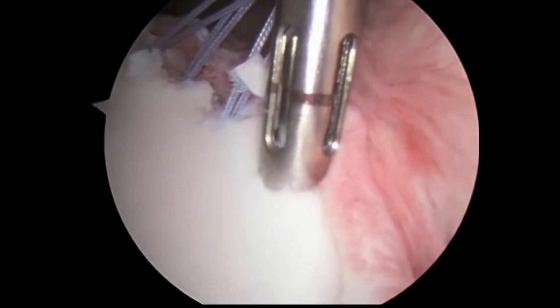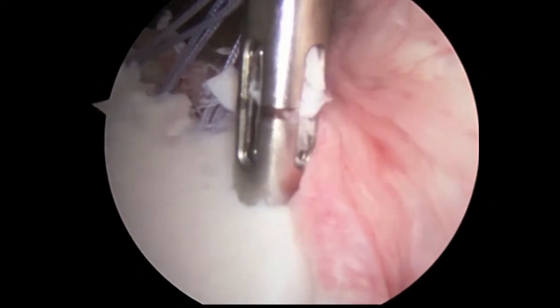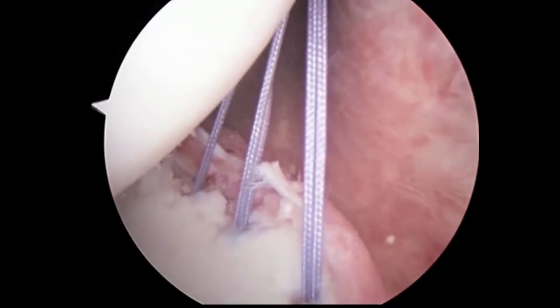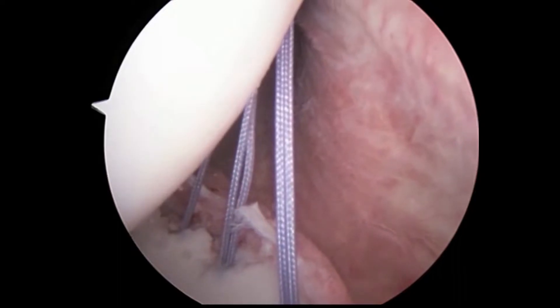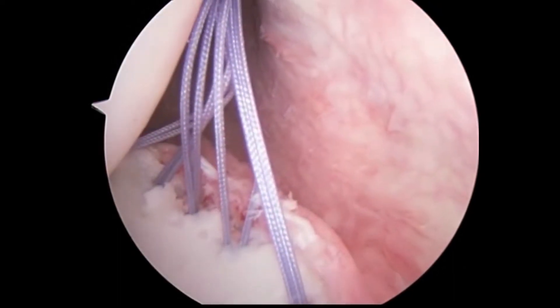The number of anchors is dependent upon the size of the tear. In this particular tear, we are using five anchors, each with one suture. Here we can see all five of the anchors.